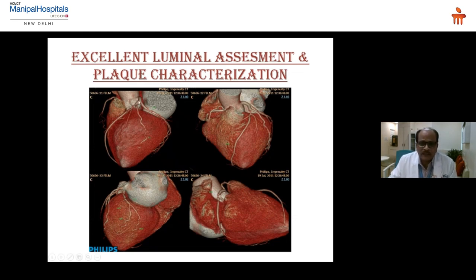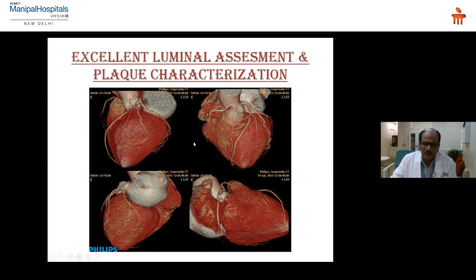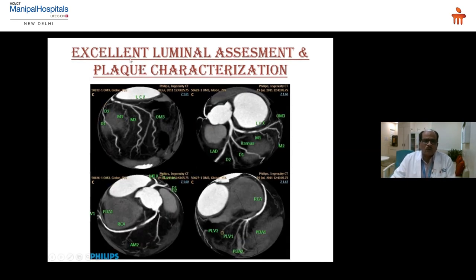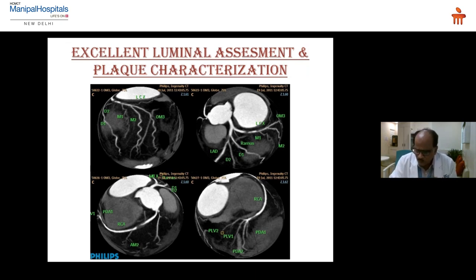A very interesting case: a very young man came with repeated low-grade chest pain and ultimately had a CT coronary angiogram. You can see the amount of disease — proximal LAD narrowing, proximal LCX narrowing, and RCA narrowing. All three major vessels are involved — triple vessel disease. This is the global view showing the LM, proximal LAD, LCX involvement, proximal and distal RCA involvement. Since it was triple vessel disease, the patient was referred for bypass surgery.